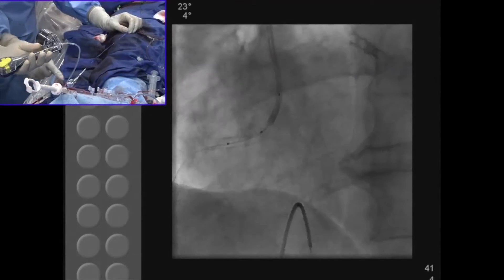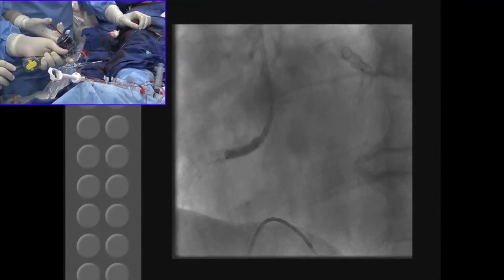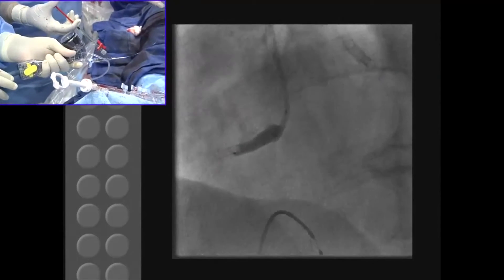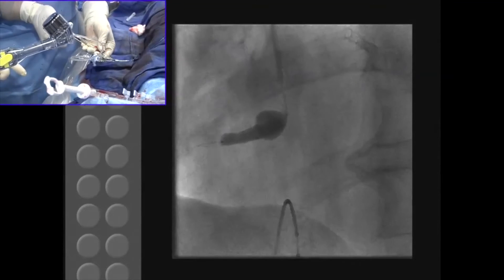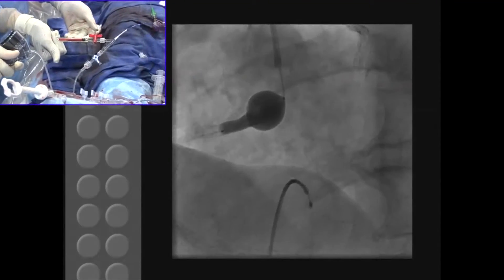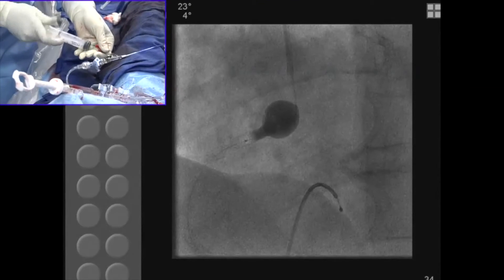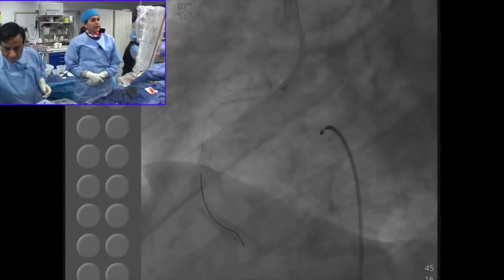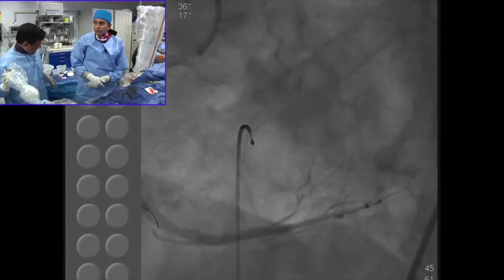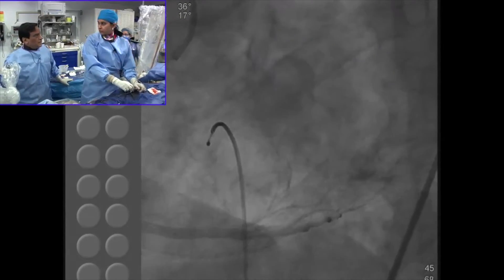We go. You will not see pressure. Inflate this — regular, 10 to 12. Give me a syringe. This is the anchoring portion. That's the distal — it is coming already. Now I'm inflating the red syringe. That's the balloon in the coronary artery. Then go with the big syringe to go negative. You can see the nice flare. It would be wonderful to put in a diagnostic catheter to take one final picture, but I think it will be okay.